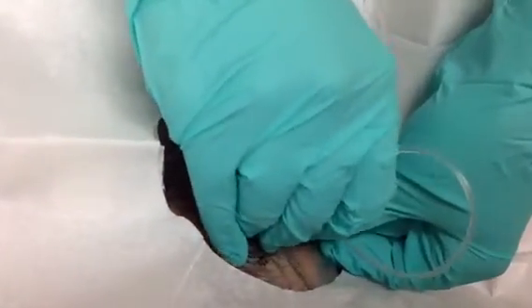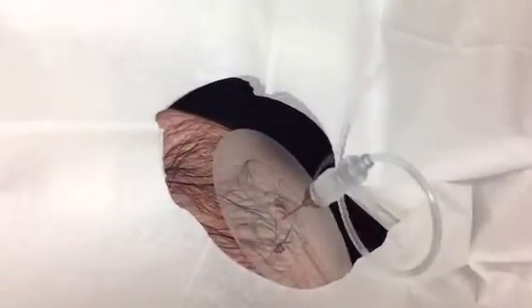Keep searching — there we are, they're in. I can feel the resistance give and then fluid comes up into the tube. Sorry about that lengthy one. That's all good.